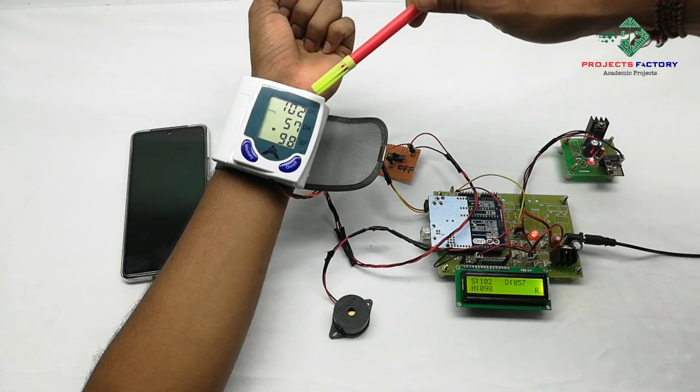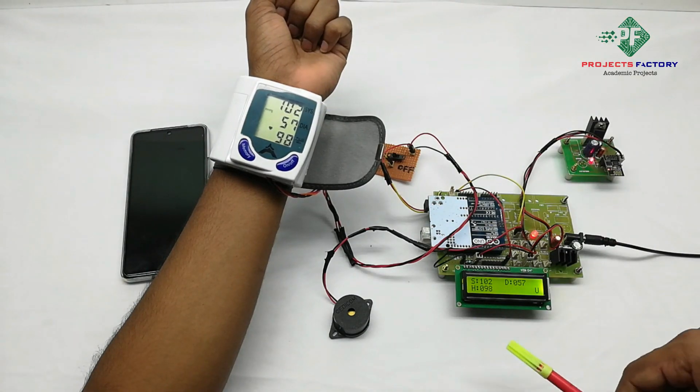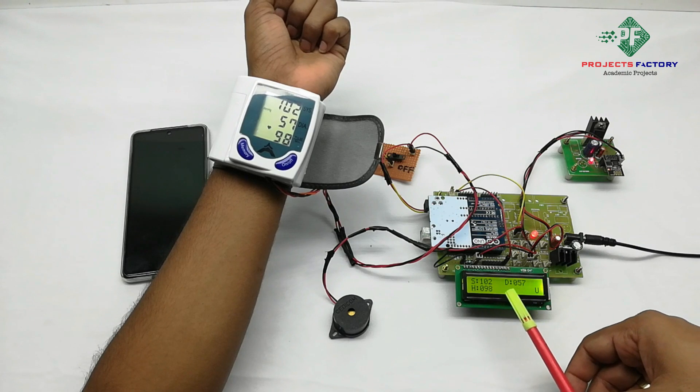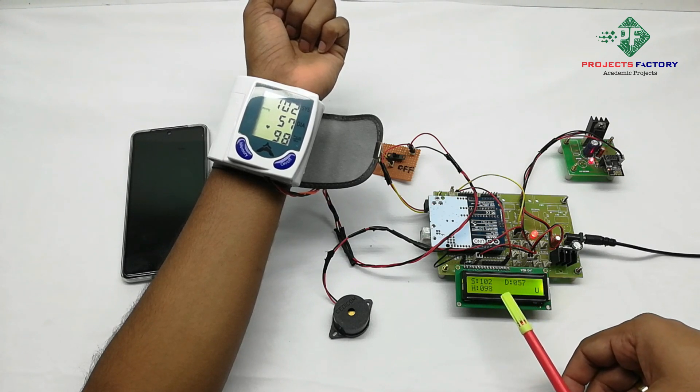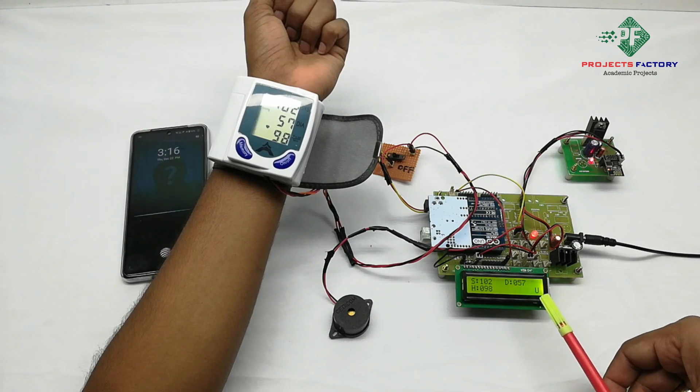We can see here systolic, diastolic, and heart pulse values displayed. The data is running to the IoT server.